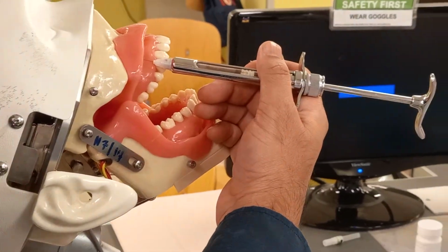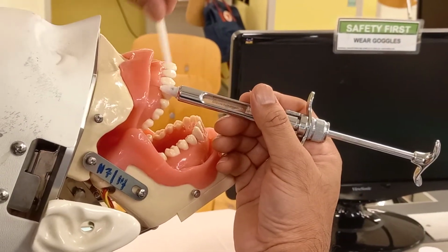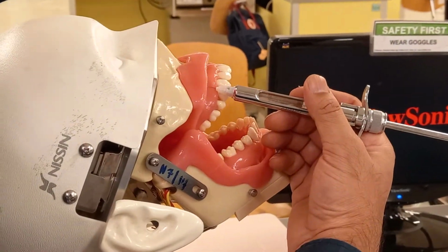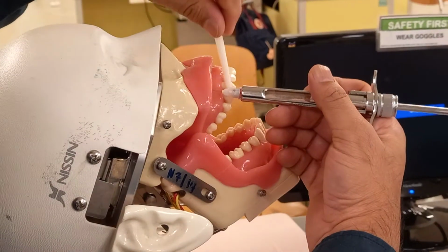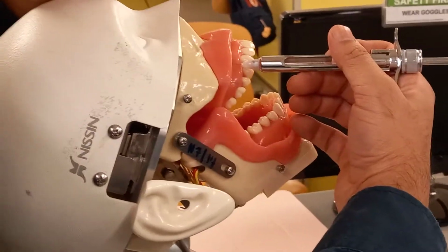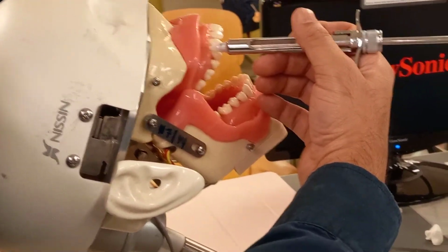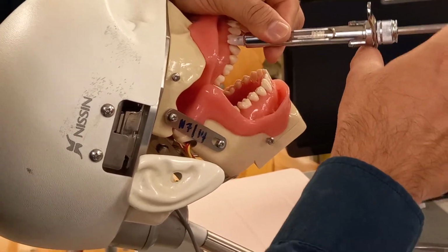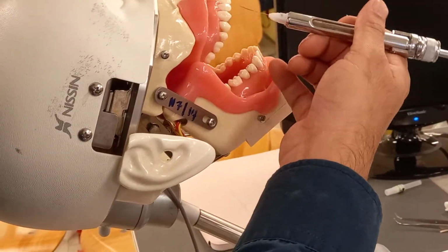In the X-ray, you need to see how long your root is. Usually you see the length of the maxilla in a patient. If it's a short maxilla, you don't have to go so deep. If it's a long maxilla, you might have to go a bit deeper. But the rest is the same. Make sure you're slightly angulated inwards, and there's a gap here. You don't have to aspirate because it's a non-aspirating technique. Then you just give 0.5 ml. Then this is buccal.